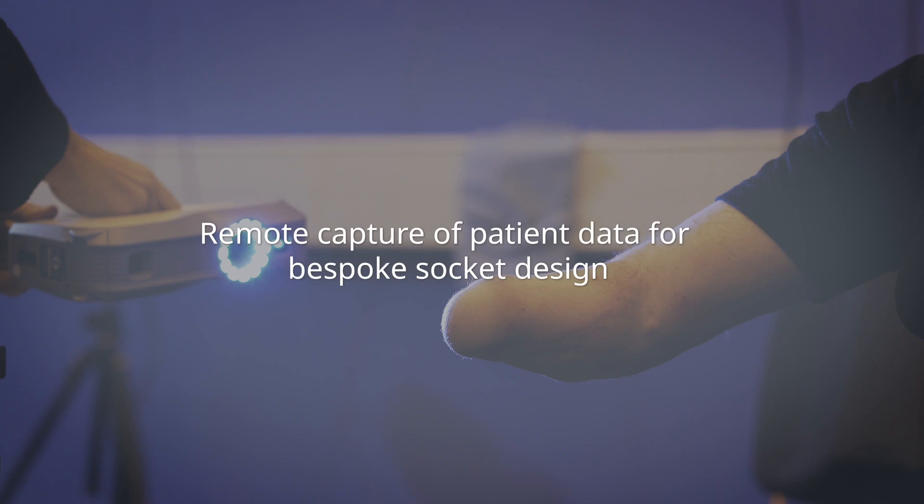If you have an amputation, you need a prosthetic limb in order to be able to walk or to do everything that you need to do with your limbs. To wear a prosthesis, you need an interface between the prosthesis and your residual limb. That's the reason why you need a socket — something that is personalised for the shape of the residual limb, and it has to be designed quickly so that you are able to come back to a normal life as soon as possible.